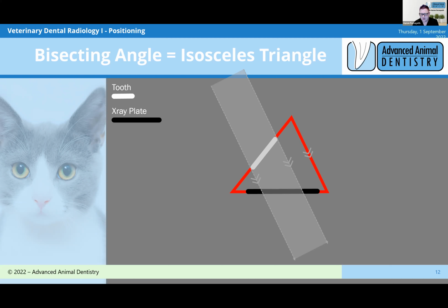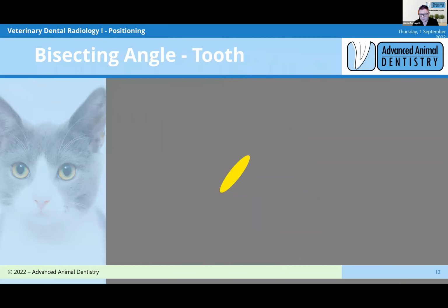I'm not sure if I kept that slide in, but I'm preempting it if we did. I know there are charts out there talking about how you set it all up. And that's fine for the dog that was in those images taken, it worked fine. But the way that it was worked out in the first place is by using this theory. Okay? And it works in the perfect sort of dog, like a Labrador head or even a Greyhound head or something like that. It's great. If you've got a Brachy or something that has slightly different anatomy, then it doesn't work.